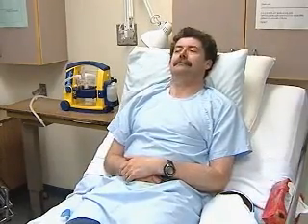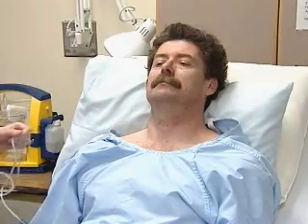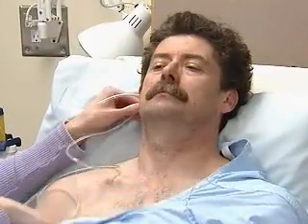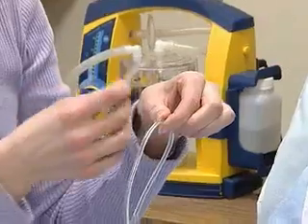Our patient is placed in high Fowler's position with shoulders well elevated. We gauge the length of tube to be inserted by measuring from the tip of the nose to the earlobe to the xiphoid process. Mark the length of tube to be inserted with a bit of tape.